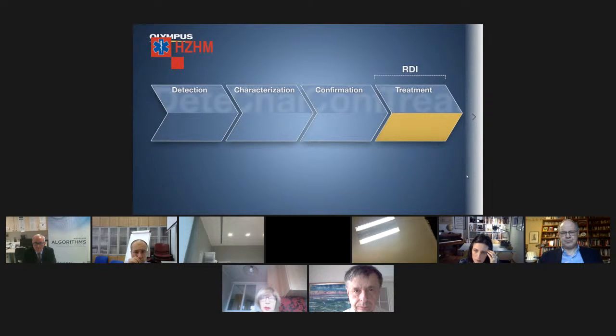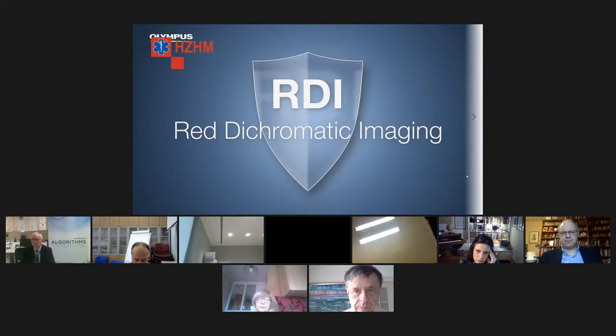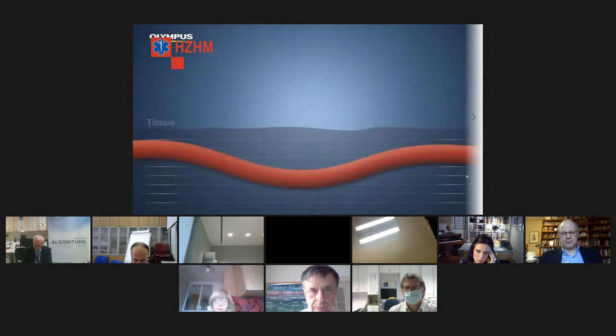Designed to enhance the visibility of deep vessels and bleeding points during endoscopic treatment. RDI stands for red dichromatic imaging. RDI uses an additional amber LED. Red light penetrates deeper into the tissue compared to green light.